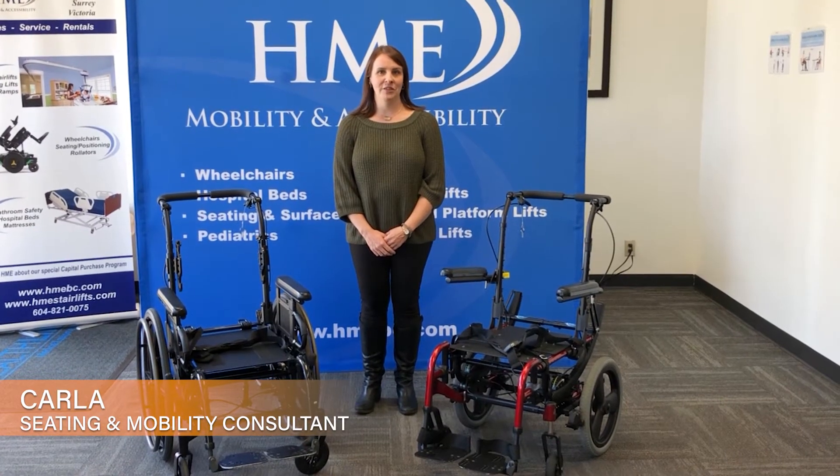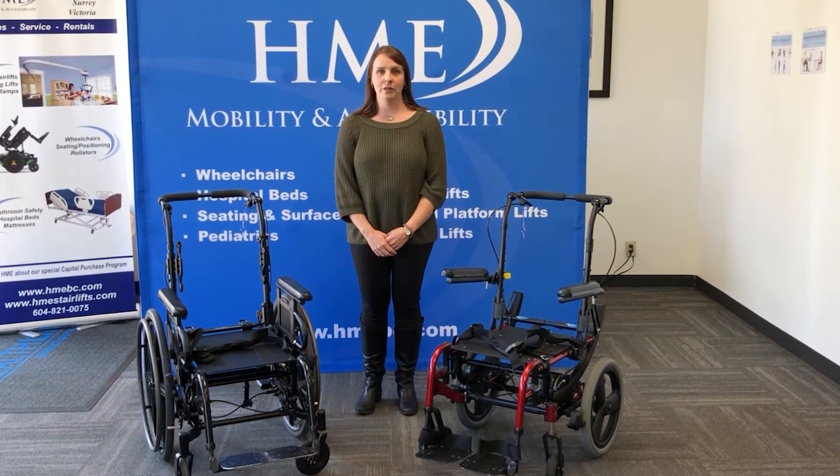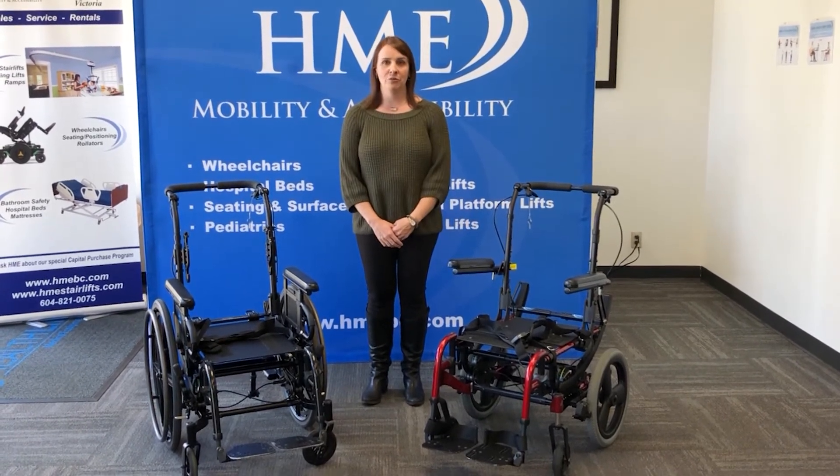Hi, my name is Carla Carrico. I'm one of the seating and mobility consultants here at HME. Today I'm going to compare for you two tilt chairs: the Quickie SR45 and the Quickie Iris. At first glance they look pretty similar, so let's go through the differences.